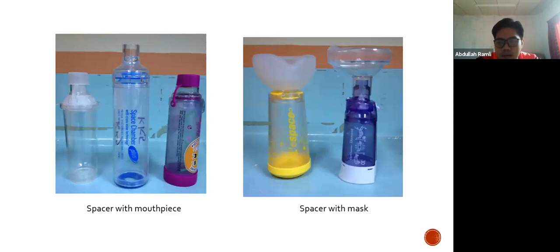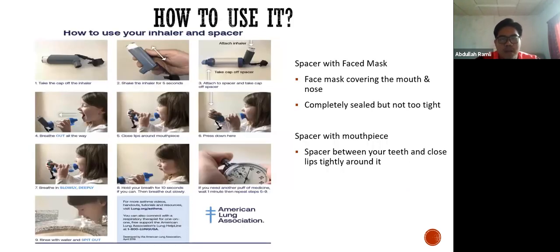So these are two examples of spacers. One is a spacer with a mouthpiece, and another one is a spacer with a mask. Okay, next. So how to use it? As you can see from the figure I attached.